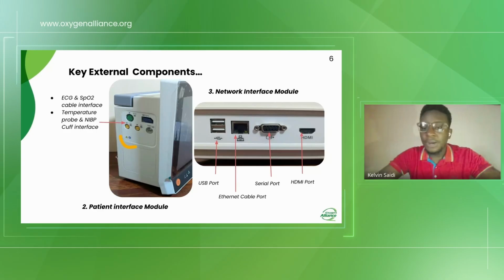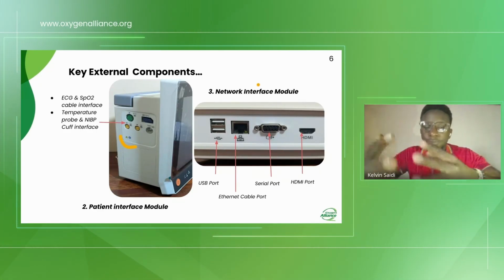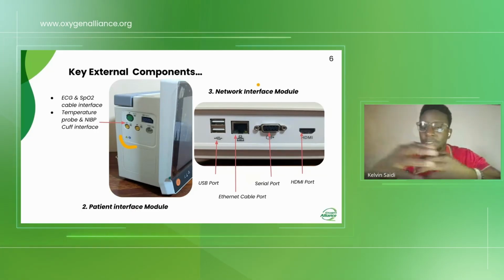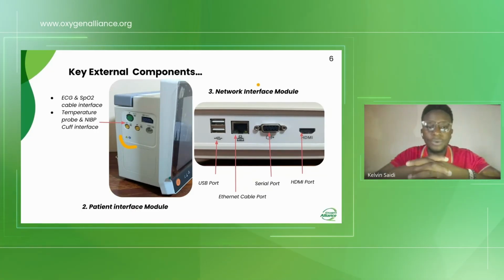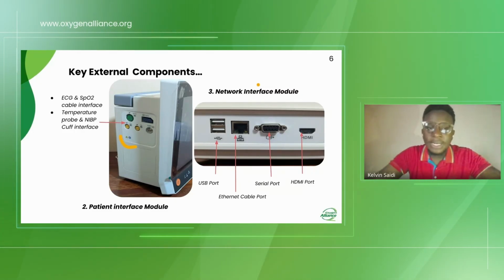And then moving on, we have the network interface module. So this is used for communication between the monitor and other devices like laptops. So it can support various network protocols, such as the local area network, serial communication, and HDMI.